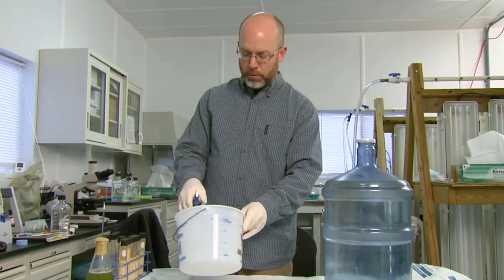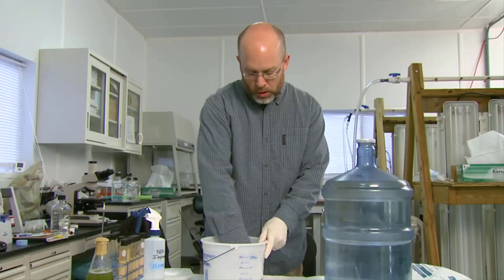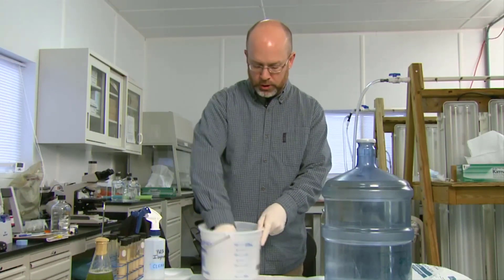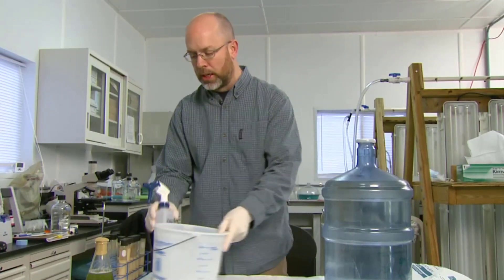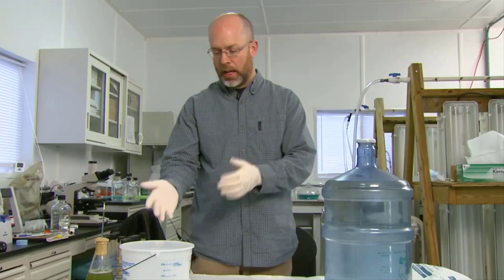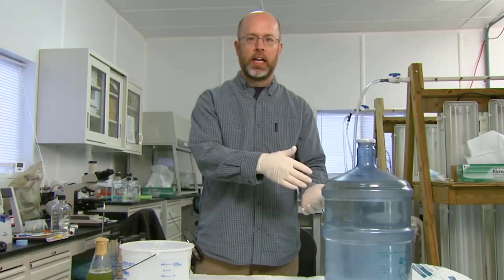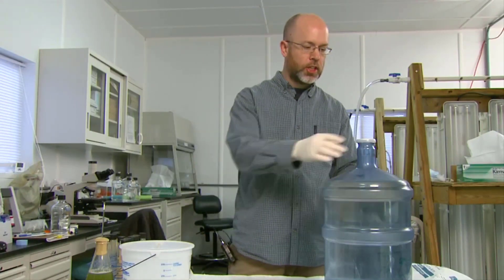So just spray this down with a little bit of 70% isopropanol, wipe it out with a chem wipe, just to be sure everything is good. The reason you do this — when you start to pour the water out of the carboy, you can get some burping as the water comes out, and the water can hit your bucket and splash back in if you're not careful. So you just want to make sure that bucket is good and sterile.